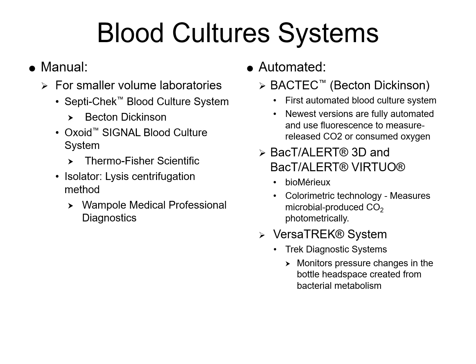But there are a few different blood culture type systems. You have manual systems that are for your smaller volume laboratories. Maybe your smaller rural area hospitals may have a system like this, just because it is a simpler system to use and it's more cost effective.